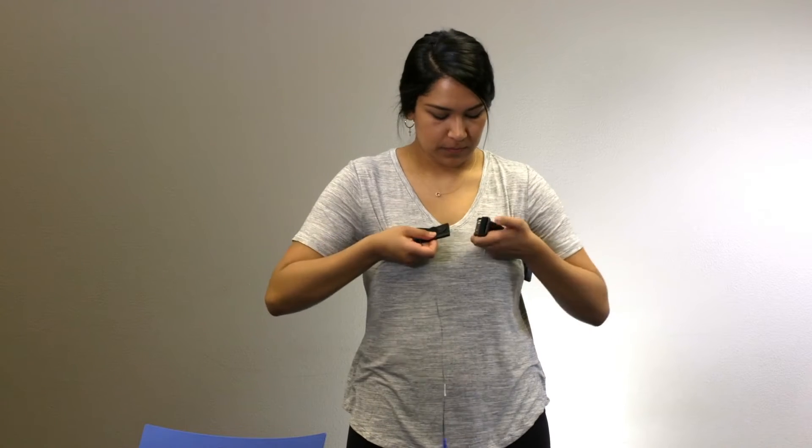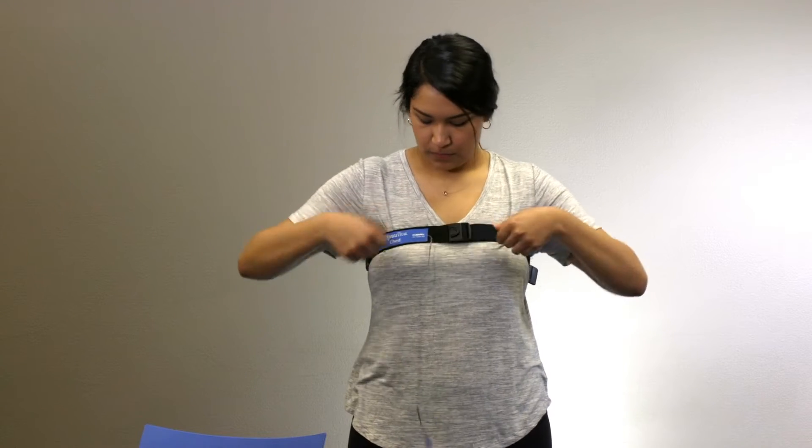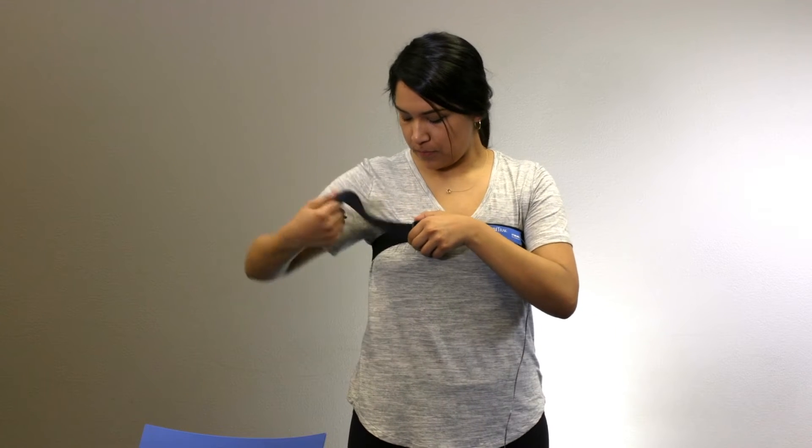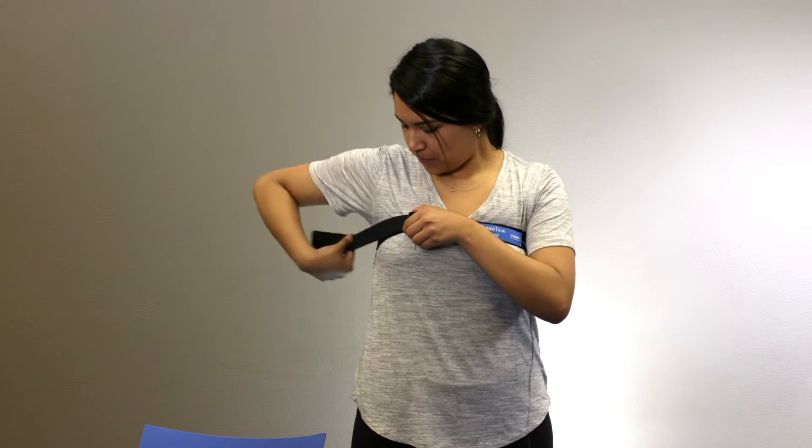Place the chest belt around your chest and fasten the buckle. Adjust it to a snug, comfortable fit using the Velcro straps.